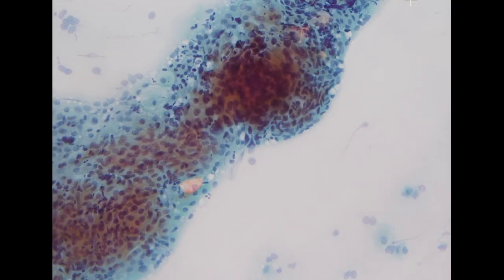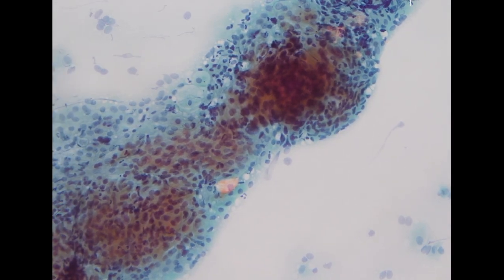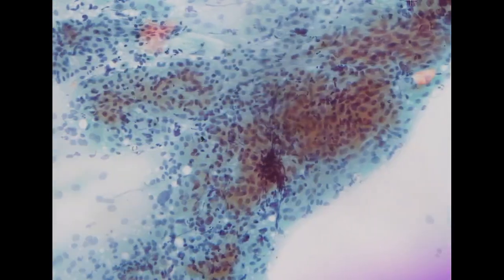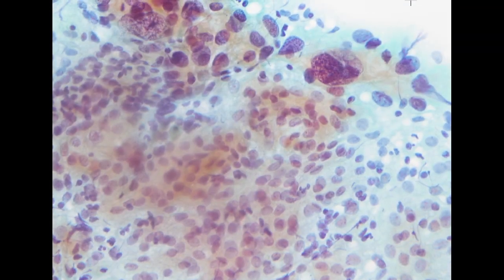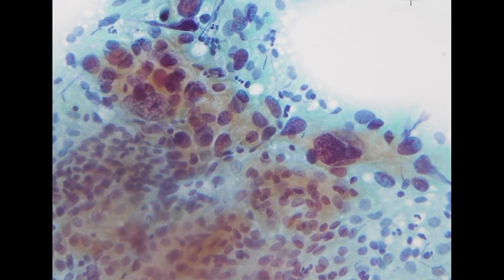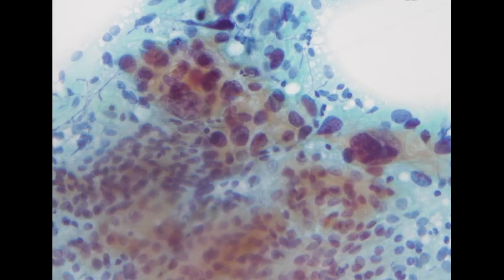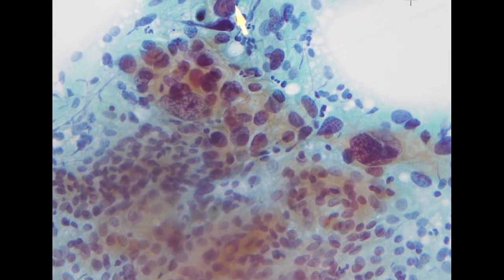For patients already in the elder age with an atrophic cervix, it is very common that we can see some enlarged cells that seem to be quite hyperchromatic. However, if you take a look at the chromatin pattern, it is mostly a degenerative or smudged pattern.